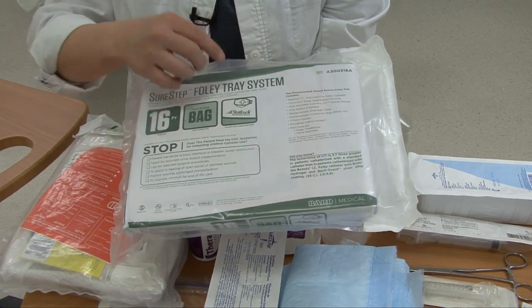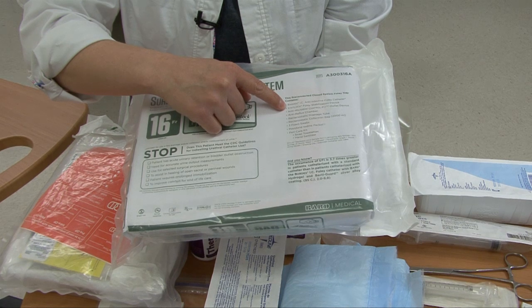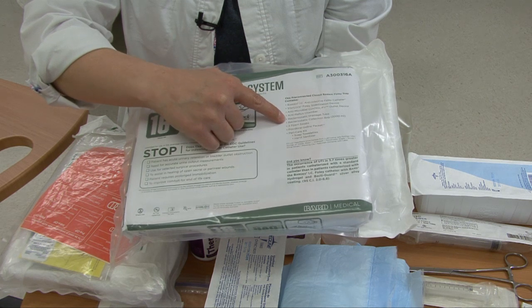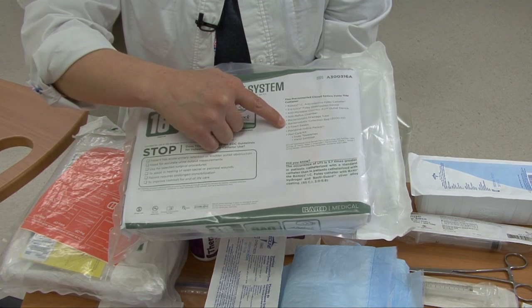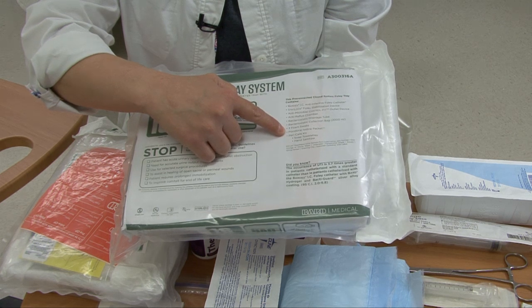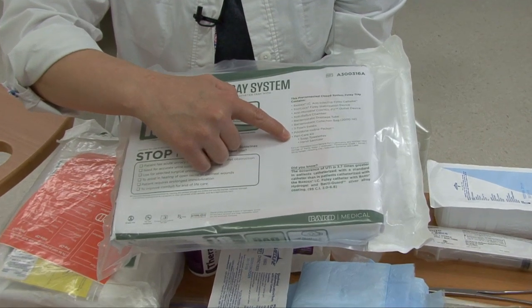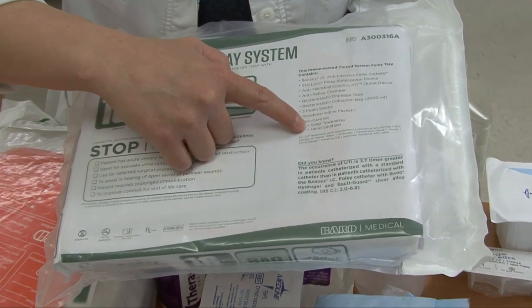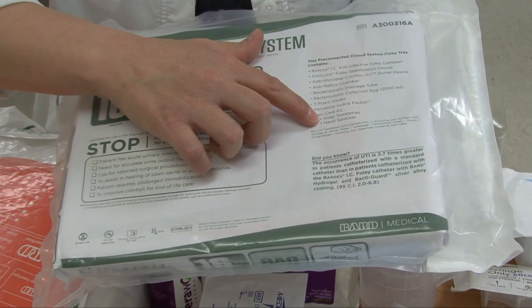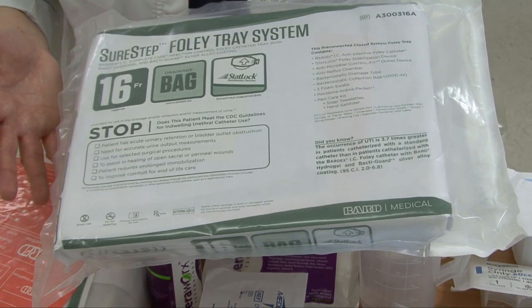The kit contains the Bardex anti-infective Foley catheter, the StatLock securement device, the antimicrobial control outlet device, an anti-reflux chamber, bacteriostatic drainage tube, bacteriostatic collection bag holding up to 2000 milliliters, three foam swabs, povidone iodine, a peri-care kit, soap towelettes, and hand sanitizer. Since this contains iodine, you would need to bring another agent if your patient is allergic. Some agencies allow you to use the soap towelettes to clean your patient, but always follow your facility policy.